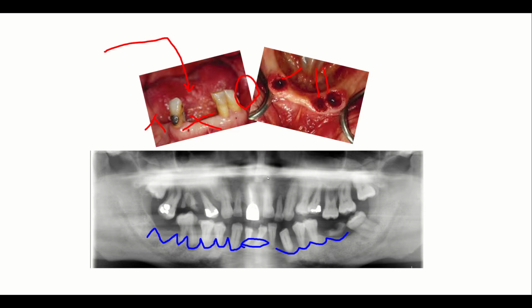simple extractions are just one or two uncomplicated teeth. So I don't know, would this fall into a simple or complex extraction? We're splitting hairs, but these would be very easy to get out.